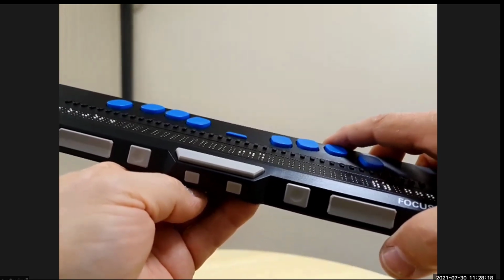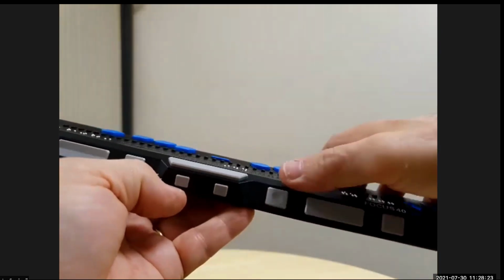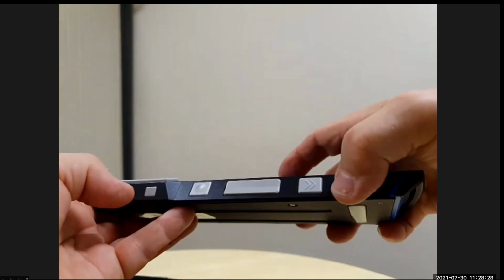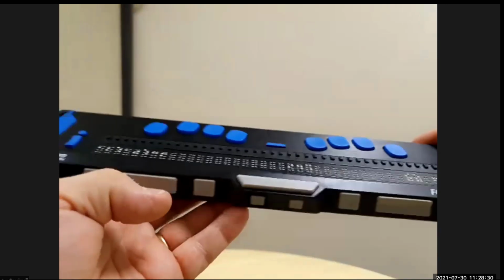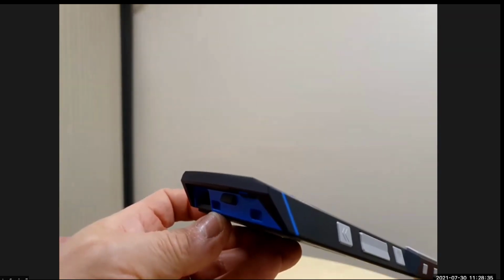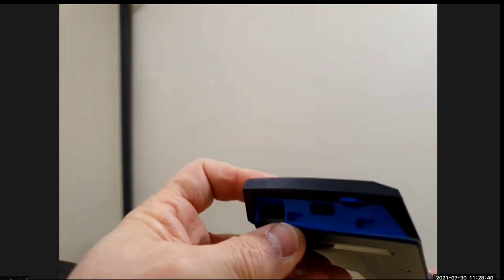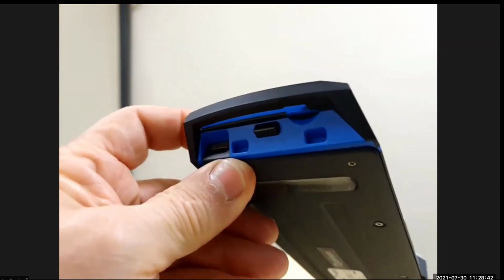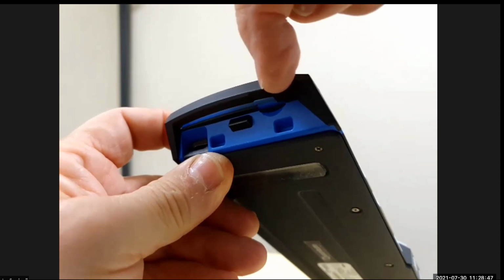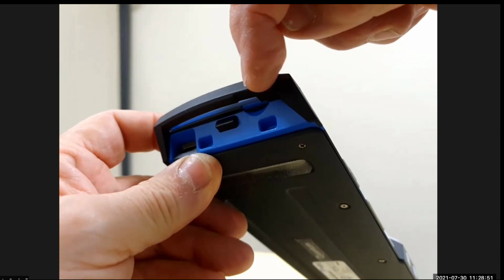Now, the right-hand side is basically the left hand in reverse. So you have your selector button, your rocker bar, and your right panning control. On the left-hand end, you have, and I'd be very, very surprised if this can even remotely show up on camera, a very, very small slot buried underneath the protective bumper on the end where you would slide in an SD card, because you are able to store files on here.